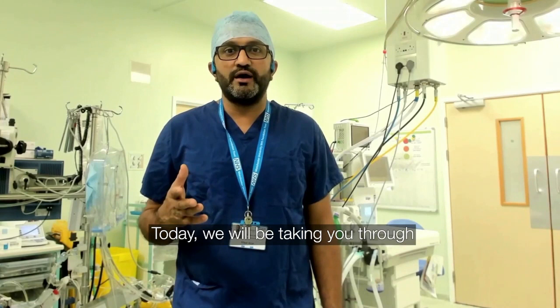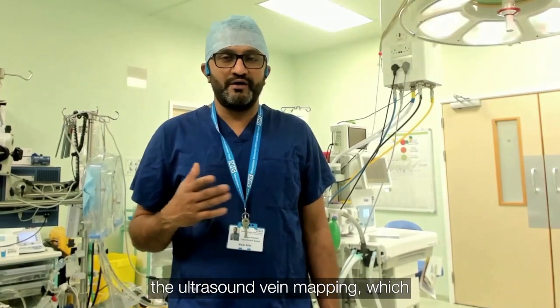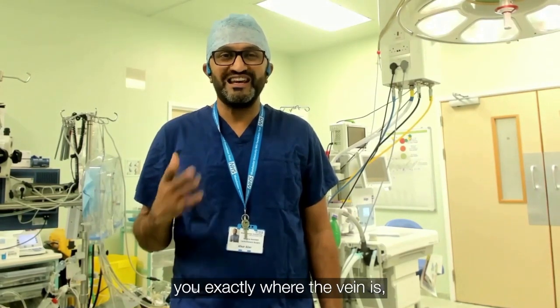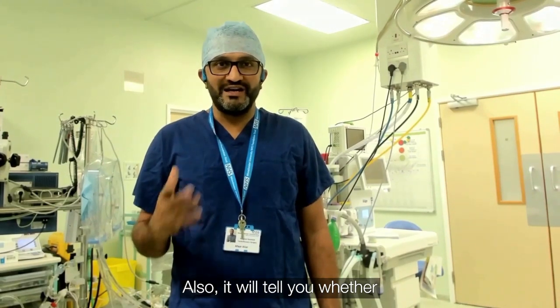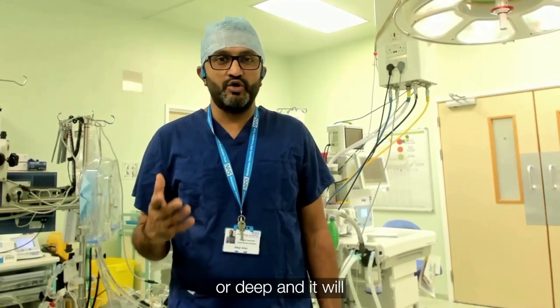Today we will be taking you through what is called a two-part video. The first part is going to be the ultrasound vein mapping, which is important for the endoscopic vein harvesting. It will tell you exactly where the vein is and where to make the exact cut. It will also tell you whether this is contraindicated in terms of whether the vein is superficial or deep.